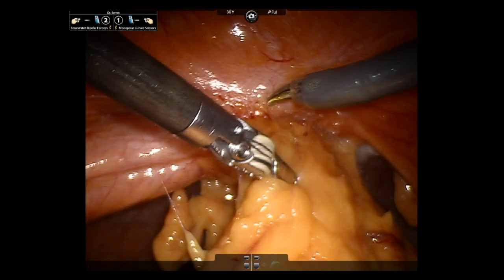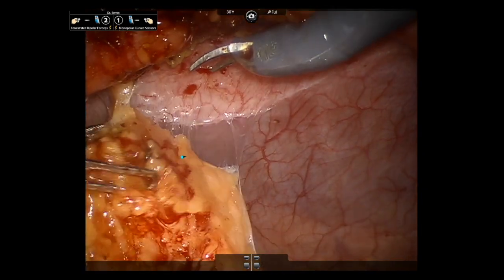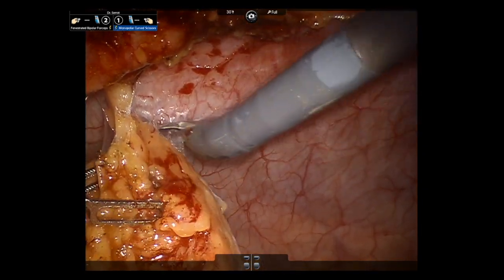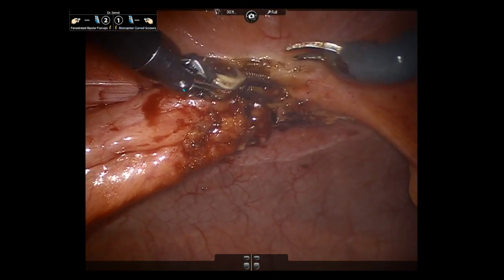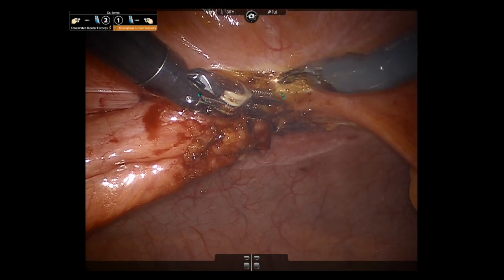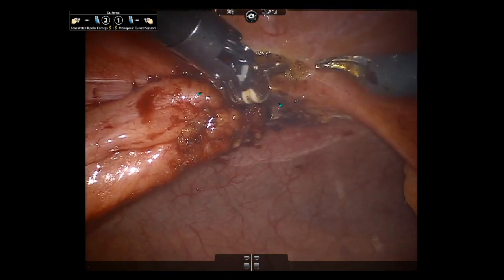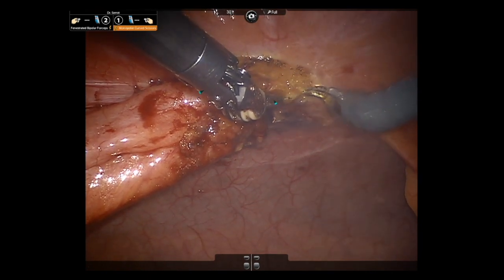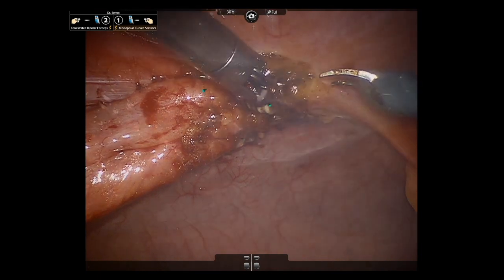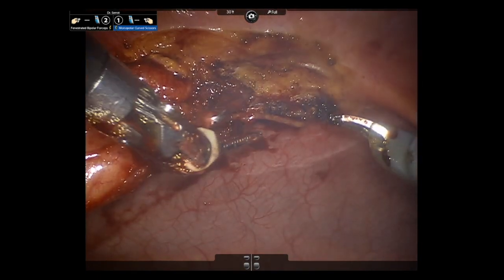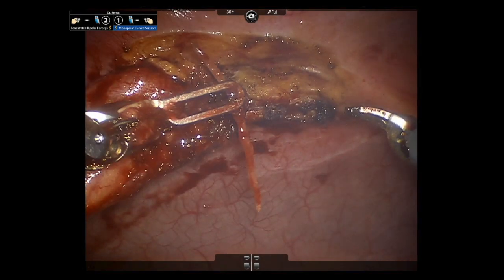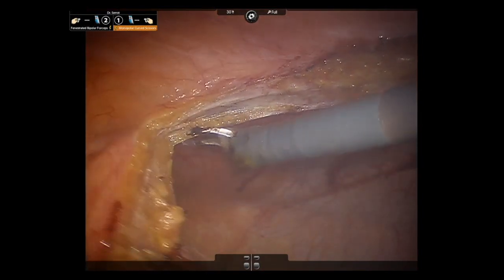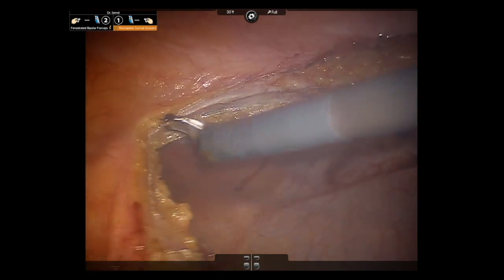After the bladder was filled with methylene blue in order to assist in identifying any urinary tract injury or bladder injury, the urachal cyst was dissected away from the anterior abdominal wall. The peritoneum and fatty tissues surrounding the median umbilical ligament were dissected away from the abdominal wall, taking care not to violate the fascia. During dissection, the calcification was encountered and was placed to the side to be removed at the end of the case along with the specimen.